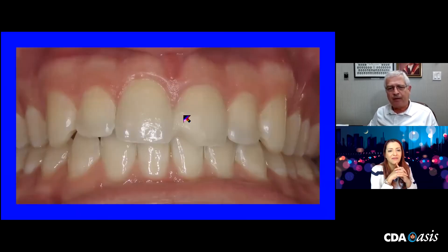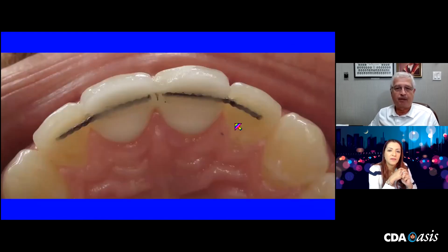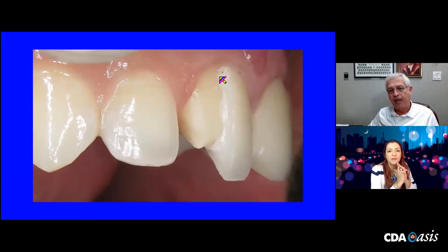He returned about a year later and he'd broken off some of the porcelain. I knew right away it was probably an issue with the overlay porcelain not being supported enough by the zirconia. But he was quite happy with the retentive setup. Noticing some refinements I wanted to make — bringing out the incisal edges — this is a neat way to use photographs to communicate with the lab. I sectioned through the zirconia and I could see the core material — that's the weakness: too much unsupported overlay porcelain.